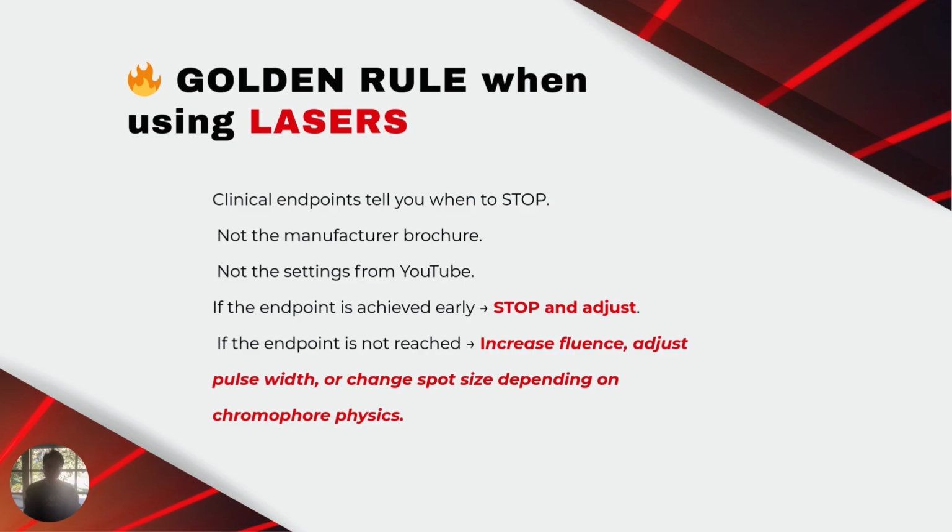Finally, we have this golden rule of lasers. Your clinical endpoints tell you when to stop, not the brochure. It's not the settings from YouTube. If the endpoint or your goal is achieved, stop and adjust. If the endpoint is not reached, safely increase or adjust your settings by always paying attention also to what's going on. The pulse width, all these parameters, spot size, depend on the target and the chromophore physics. So bear that in mind.